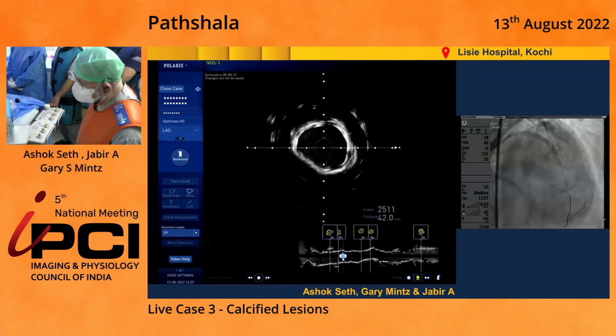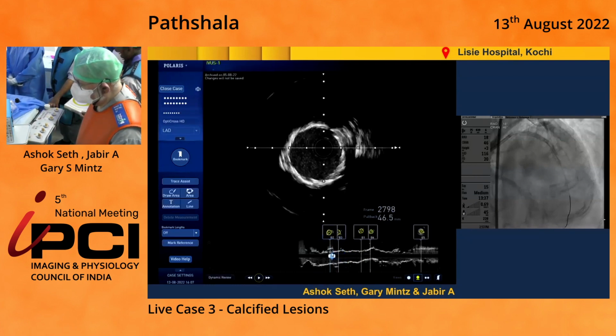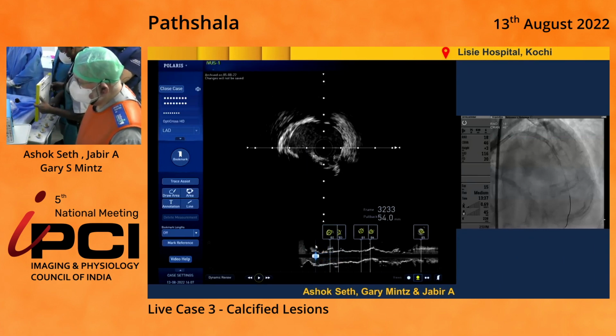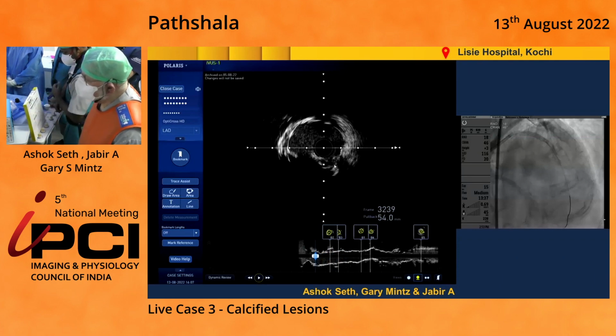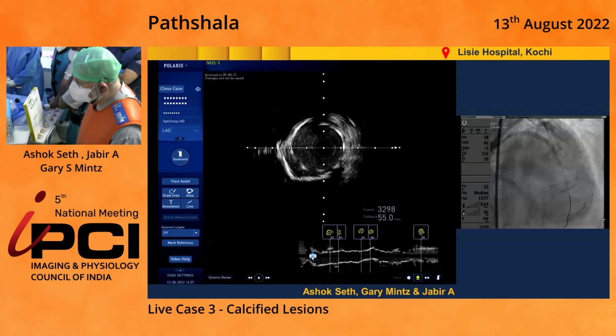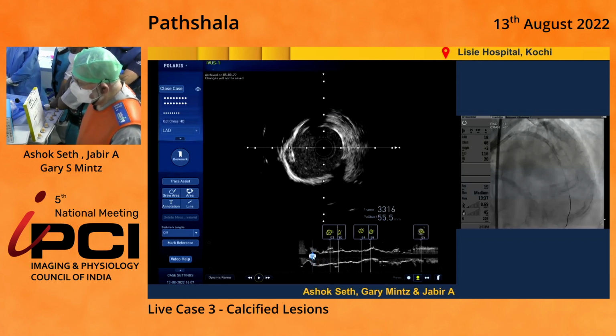And then we're going to get to an area more proximal, which I will again hasten. So this is probably the original lesion. And it's likely that this represented a calcified nodule as the cause of her STEMI back in June. The other point that's important is when we get to the proximal edge, we see a few malapposed struts, which is okay.